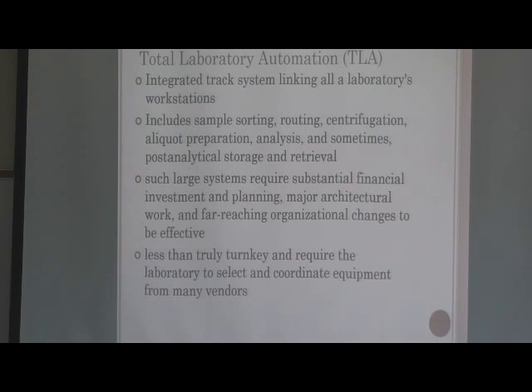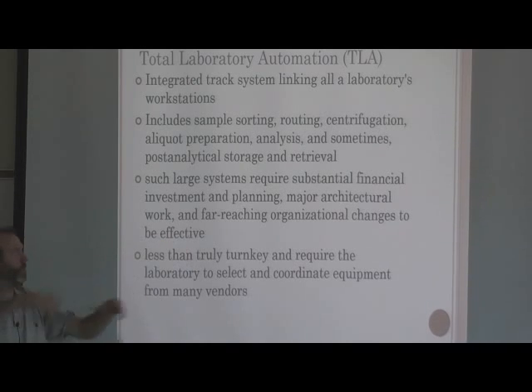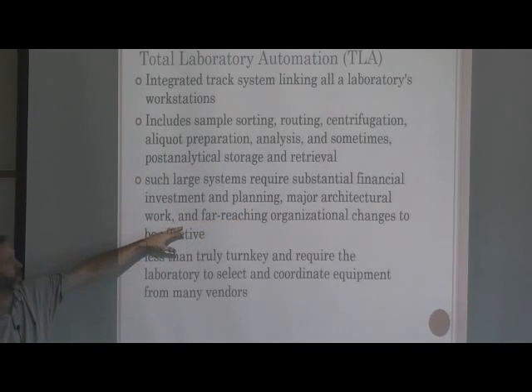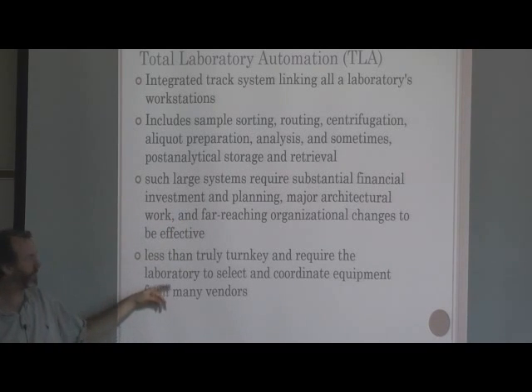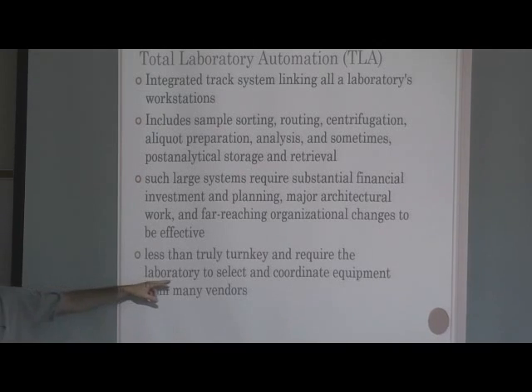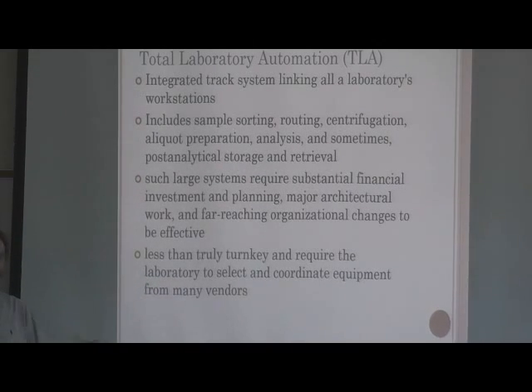And I'll show you a little movie that I found on YouTube that has one of these systems, and they take you through all the different processes. They're huge systems. They take up a big room, and it requires major architectural work, far-reaching organizational changes to be effective in planning, and they're really expensive to purchase. They're pretty much less than truly turnkey, and they require a laboratory to select and coordinate equipment from many vendors.